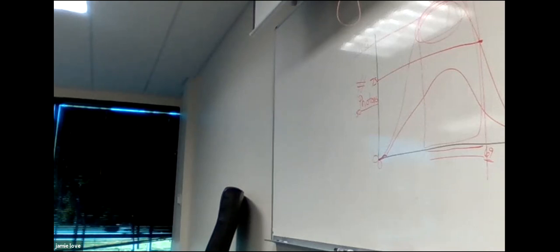Our number of X-rays peaked up because we doubled the mA. But the energy didn't shift that much. The kVp didn't change, just the number of photons. So by changing mAs, you're only changing the number of photons. That's one good thing. mAs doesn't affect anything else. It's only the number of photons.